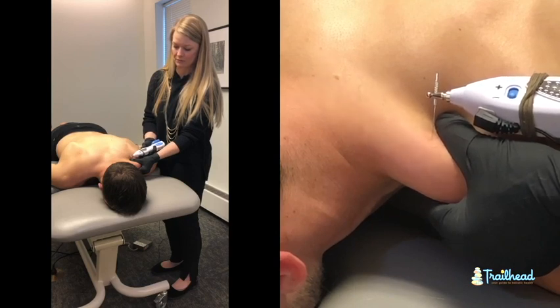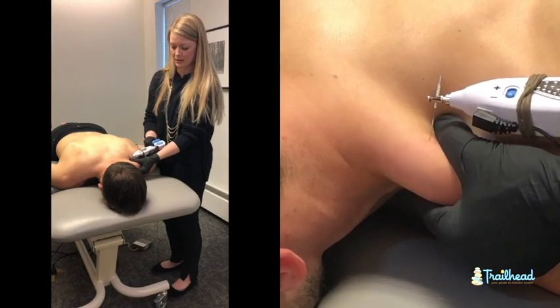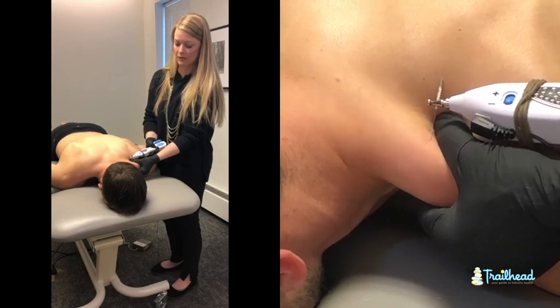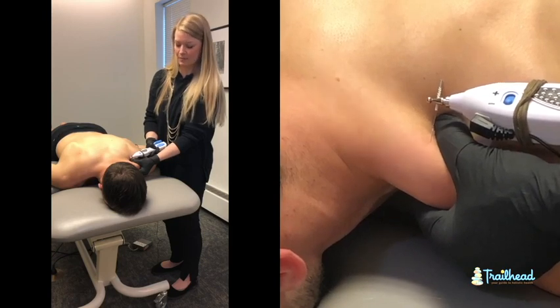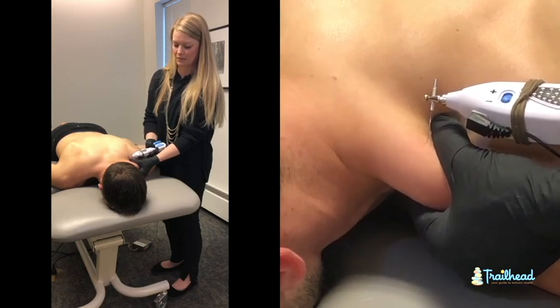You should start to see that muscle fire. While I am treating Mike, I might play with how quickly or slowly I am using that, or how that twitch frequency is being utilized. If I go nice and slow so Mike has a slow twitch, that is going to focus on getting some blood flow — getting some good nutrients in and getting some of that what I like to call sludge out of the muscle. If Mike was having a hard time firing this muscle, I might turn that twitch frequency a little faster, and that is to start encouraging neurotransmitter, which is the chemical that goes from the nerve to the muscle, to run across there and get that muscle firing better.